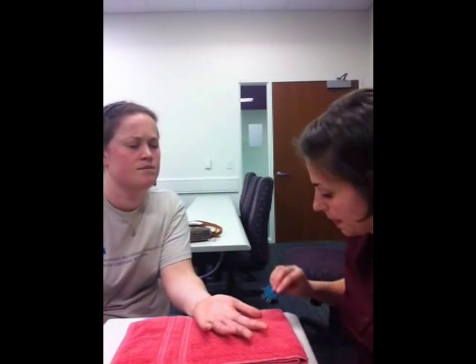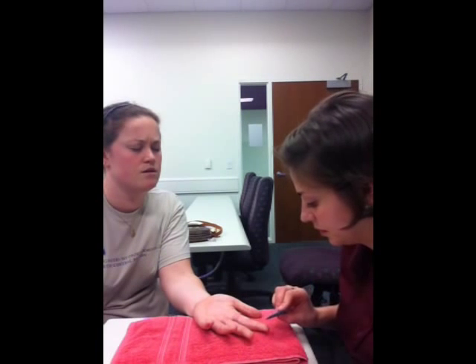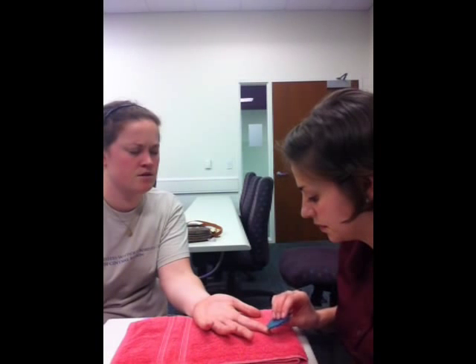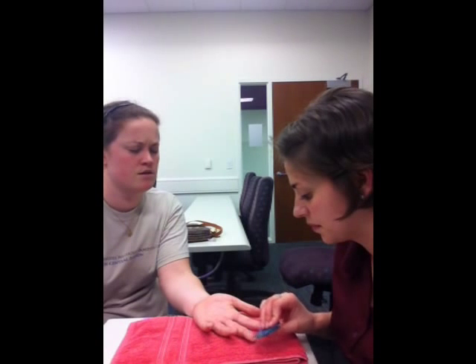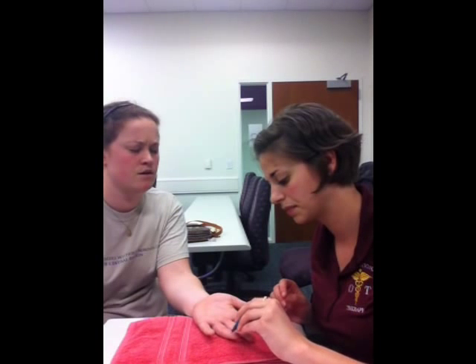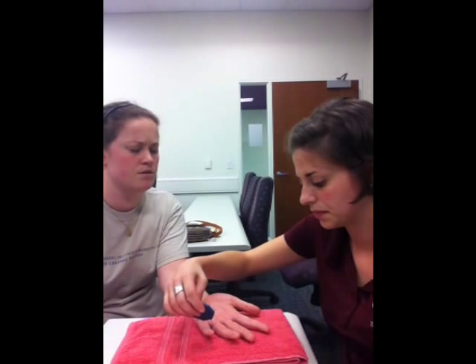Two. One. Two. One. Two. One. Two. One. Two. One. Two. One. Two. One. Two. One. Two. One. Two. One. Two. One. Two. One. Two.